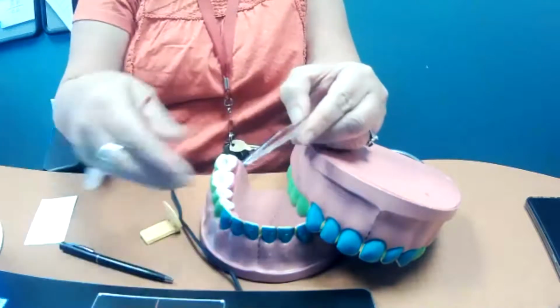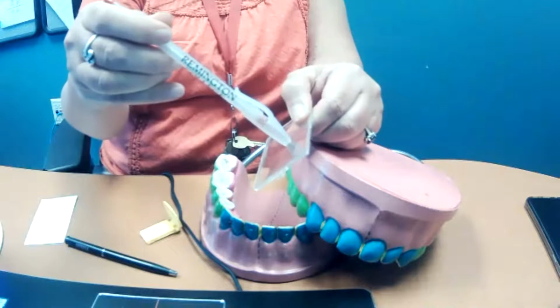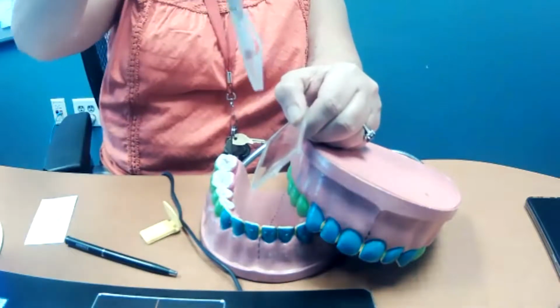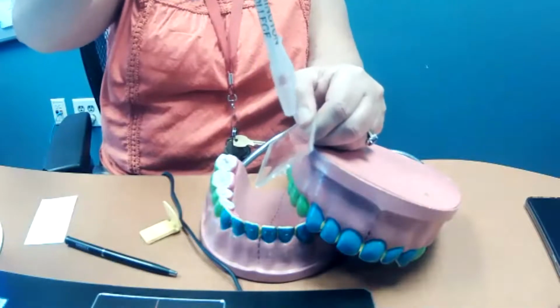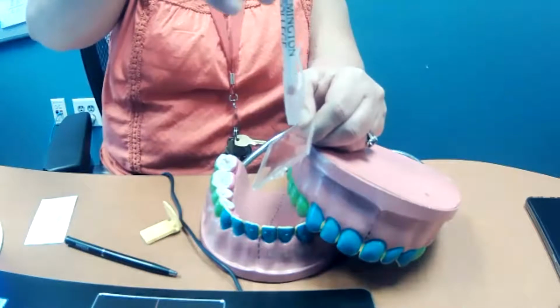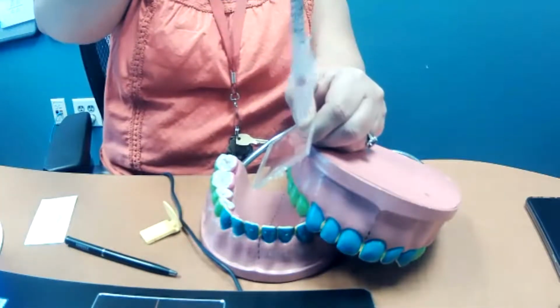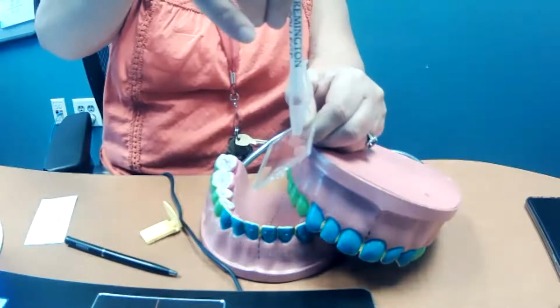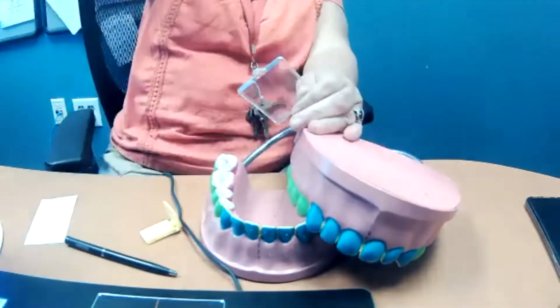But if you think about it, if I'm not perpendicular to my film and I'm at an angle like this, and my angulation is too much angulation, it's going to make my image look shorter, right? Because I'm shooting down on my tooth. It's just like if you're taking a selfie, right? And you hold the camera all the way up here, right?